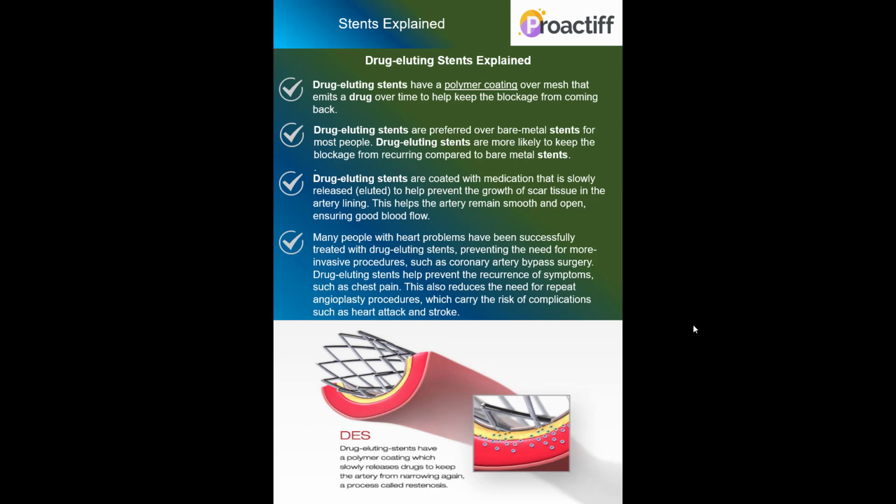for more invasive procedures. So this is less intensive, minimally invasive and much faster to be done, but it depends upon the choice. Early stage intervention would allow putting in stents instead of doing complex surgeries after the infarction. And as you can see, for the coronary artery, instead of the bypass, the drug-eluting stents could be leveraged to prevent the recurrence of the symptoms, especially angina or chest pain.